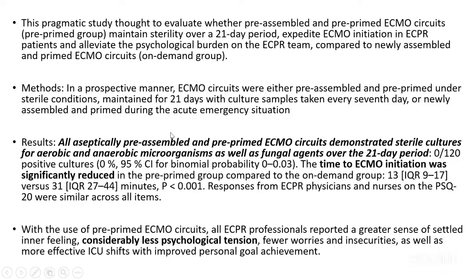So they concluded that the ECMO circuit can be maintained without any kind of infection. That is one thing. Second, the time to ECMO initiation is significantly reduced. For example, it decreased to 13 minutes as compared to 31 minutes in the other group. So the time of initiation of ECMO has improved. This can give support in a better way.